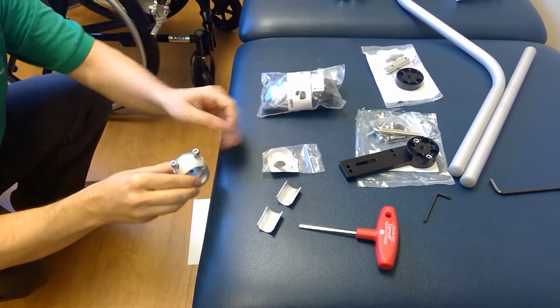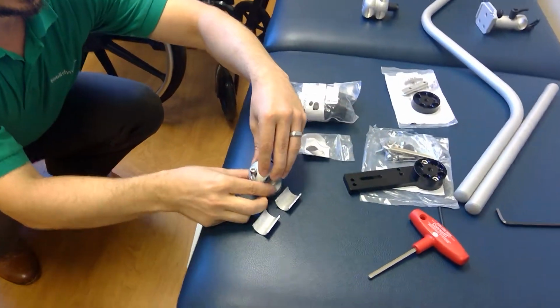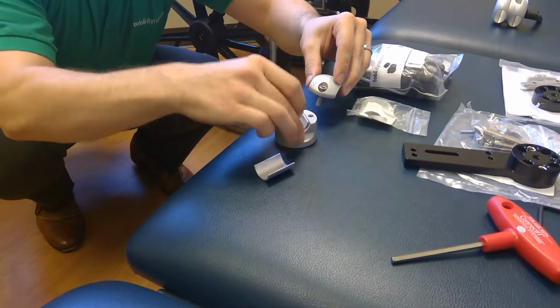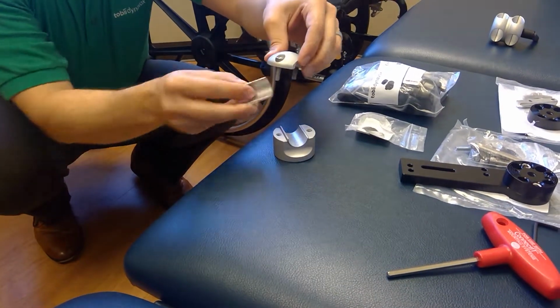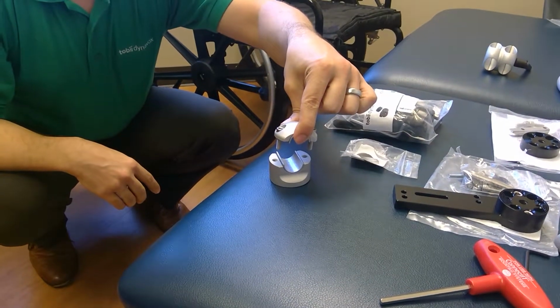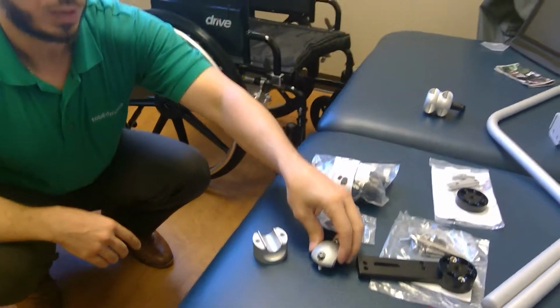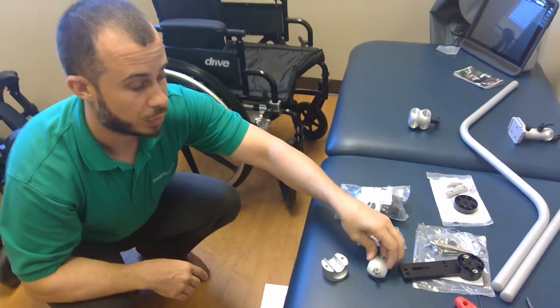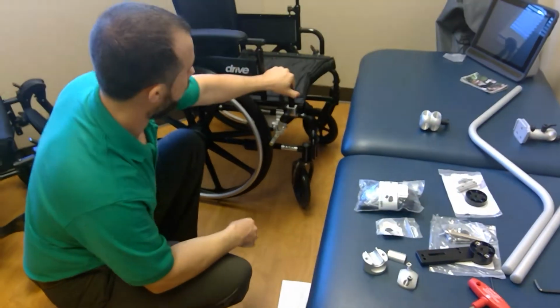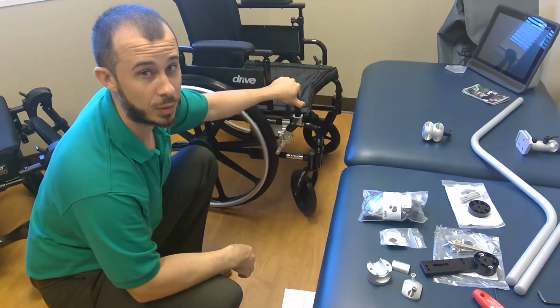So what you do with these reduction sleeves, move this out of the way, is we open up the mount fastener, and the reduction sleeves simply sit in there. So when you attach it to the mounting system, you're now attaching to a 7/8 inch mount, or I'm sorry, a 7/8 inch tube. So it kind of gives you two mounting solutions in one part number. Okay. So that's a little bit on a standard non-tilting chair.